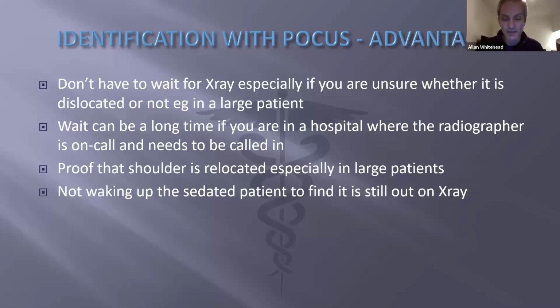And there's nothing more frustrating than doing a procedure on a patient, such as relocating a shoulder, and you've given them procedural sedation, where you've got a bit of a limited time to do the procedure. Otherwise, you've got to keep giving them more sedation. And then there's nothing worse than thinking that you've relocated the shoulder, and then you allow them to wake up, and then you get an X-ray, and you actually realize, unfortunately, that you never got the shoulder back in.